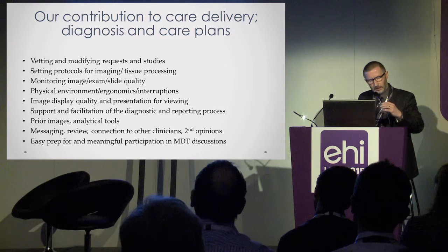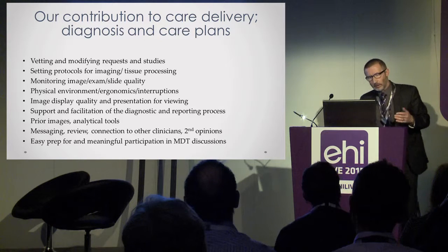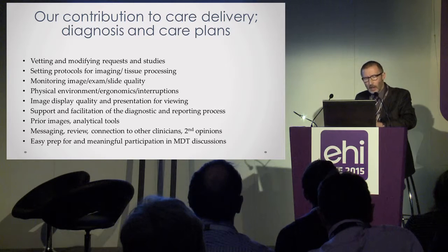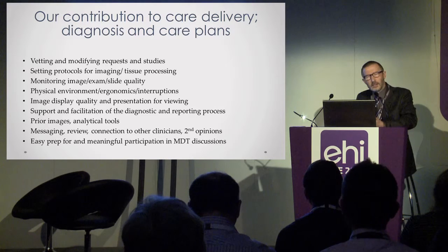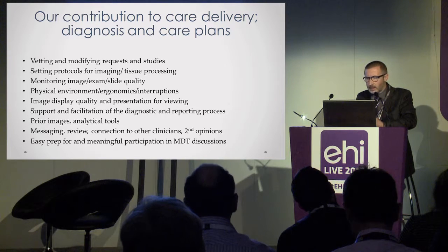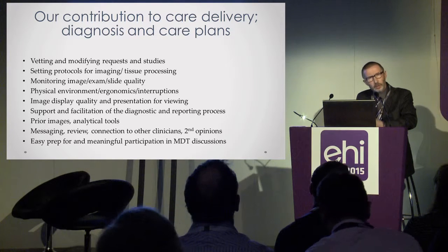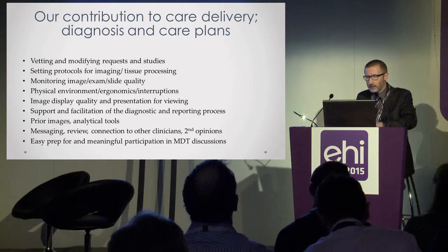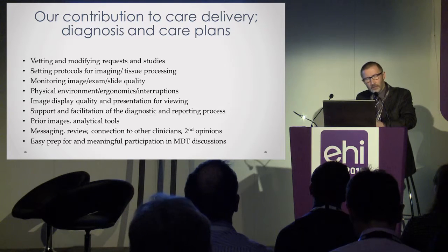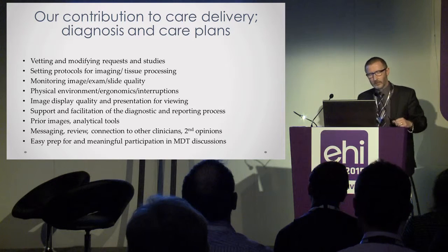In terms of the actual system that we're using to view the diagnostic material, image display quality is vitally important, but it's more than just image quality. It's how the images are displayed, how the system supports and facilitates what we're actually trying to do. And the challenge is really for us to optimize the act of diagnosis and to minimize the mechanics of the reporting process so that we can really concentrate on the key activity, and that is the key activity of making a diagnosis. Part of this support means having prior images and proper analytical tools, added value software.